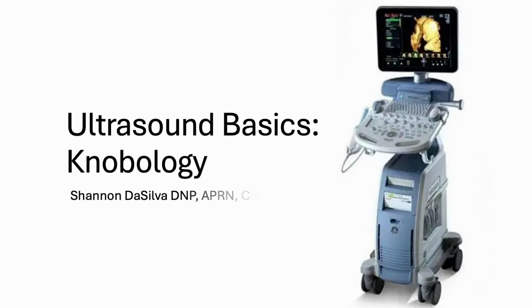In this presentation, we will go over knobology. Many of you have likely seen an ultrasound machine in obstetrics, maybe on your unit, maybe in a clinic, maybe on yourself or your partner. It can be quite overwhelming to see all of the knobs, all of the buttons, all of the things, and quite intimidating. Maybe you don't want to mess things up, you don't know what they're used for. I've been there.